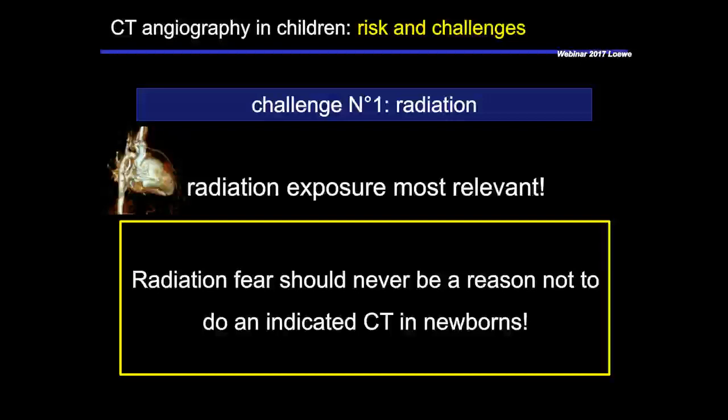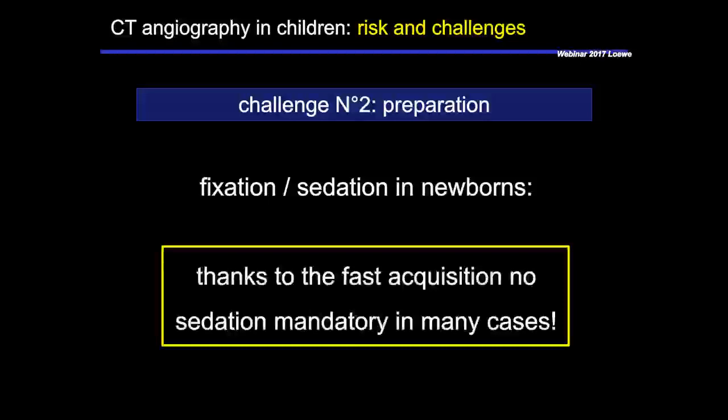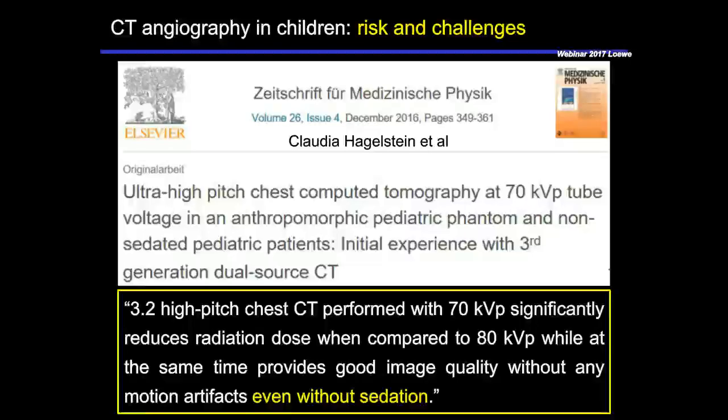The second challenge was always the fixation and sedation in newborns, but this is not an issue anymore, because thanks to the fast acquisition you don't need any sedation in most cases. So in small children, you don't need it. It has even been published that by using the very new scanners with very short acquisition times, you can scan neonates and small children even without sedation.